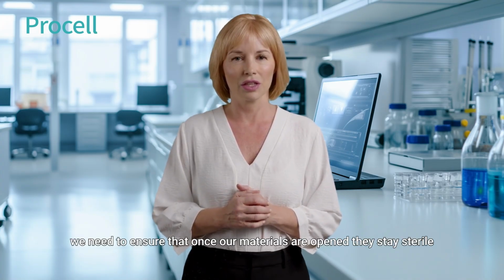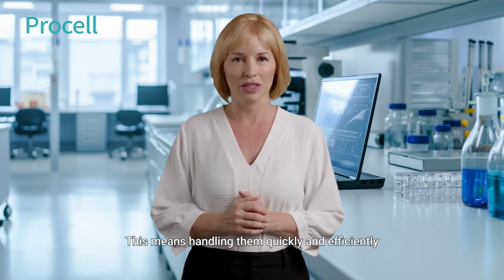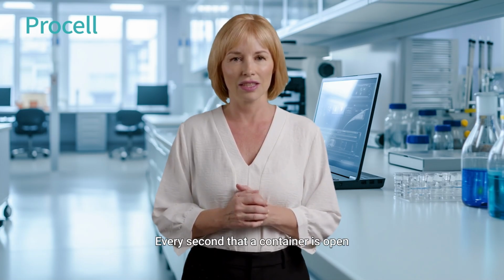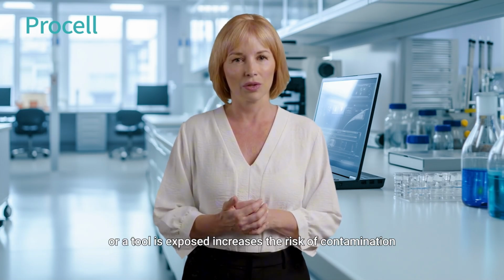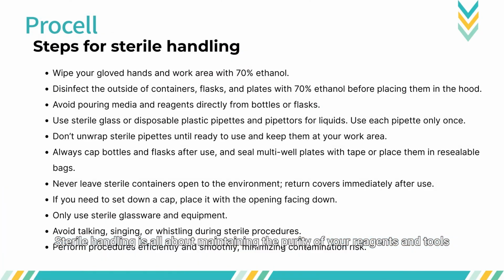Additionally, we need to ensure that once our materials are opened, they stay sterile. This means handling them quickly and efficiently, and avoiding unnecessary exposure to air. Every second that a container is open or a tool is exposed increases the risk of contamination. Sterile handling is all about maintaining the purity of your reagents and tools, and it ensures that no unwanted microorganisms are introduced into your cell culture system.